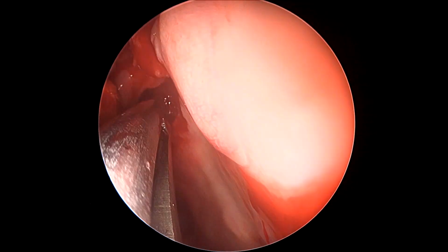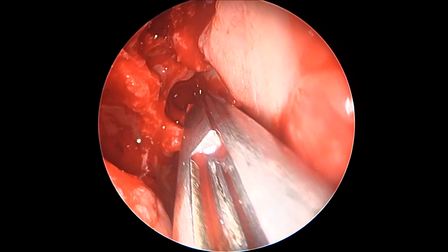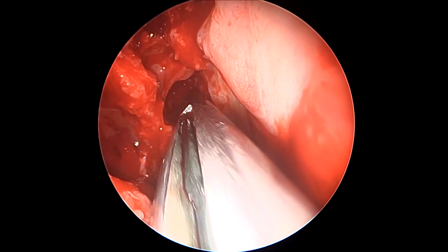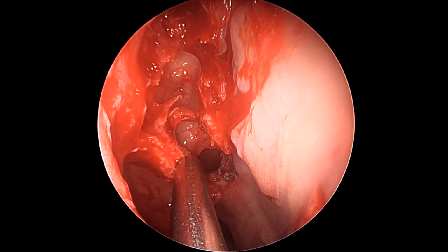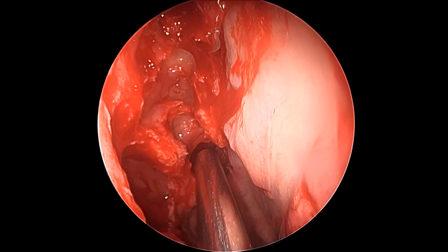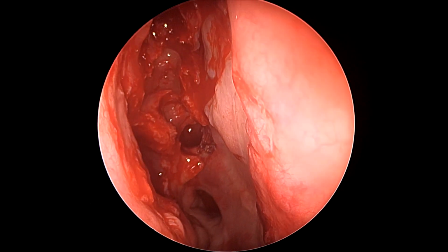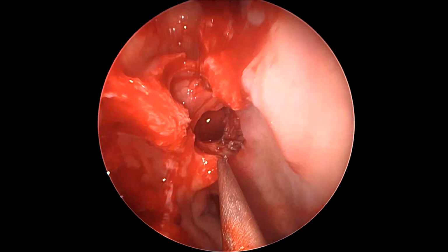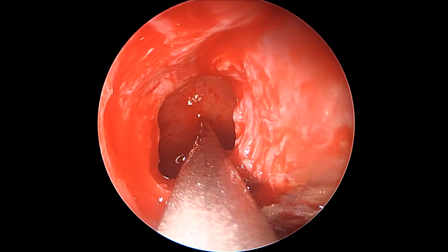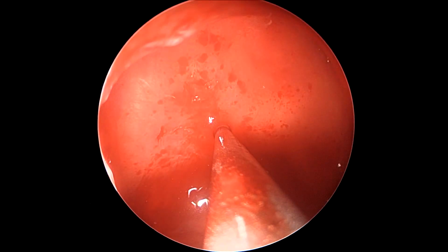Now, once the sphenoid os has been opened, it can be enlarged inferiorly and inferolaterally using a straight Hajek-Kofler bone punch. One has to be a little cautious here not to go too low without elevating the mucosal flap, because that can injure the septal artery, a branch of the sphenopalatine, and again lead to unnecessary bleeding and wastage of time. Once we have entered the sphenoid sinus, our navigator probe now points to the sella turcica, in the sellar bulge, seen in front of us very clearly.